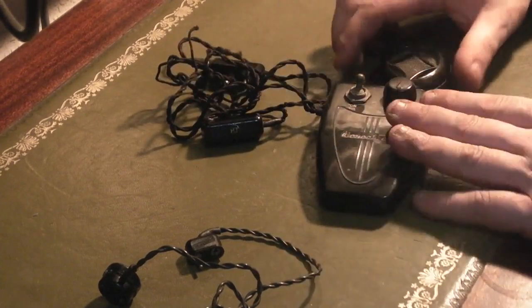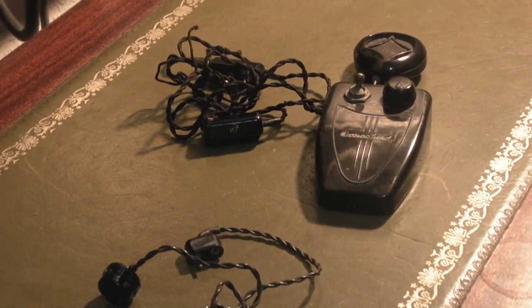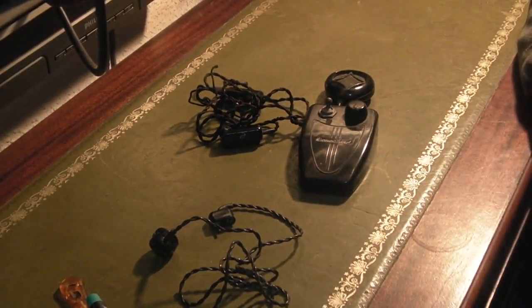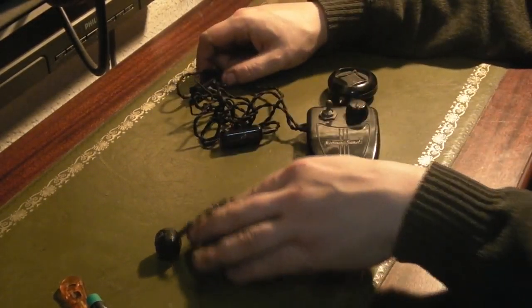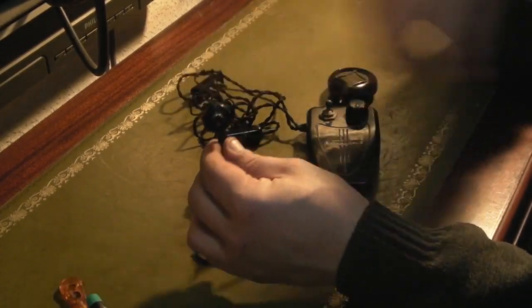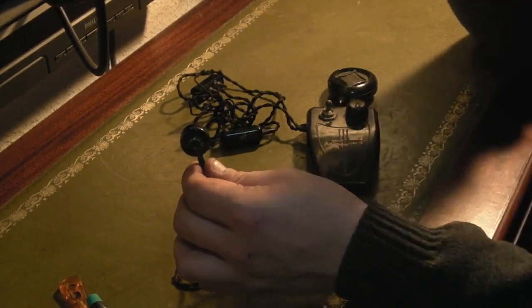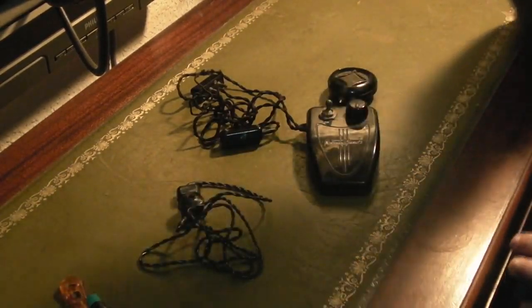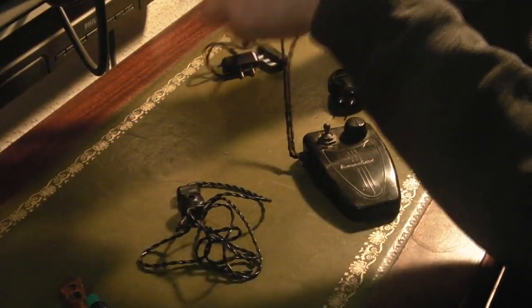So basically what we've got: we've got the main unit here, the microphone there — let me just zoom out a bit so it's a little bit easier to show. We've got the microphone there, the main unit, and obviously the headphone there. This is an earpiece type; they also produced these with a standard headphone that went over the head with two headphones on it. So this has got the earpiece, and then on the main unit we also have the original cloth-covered wiring.